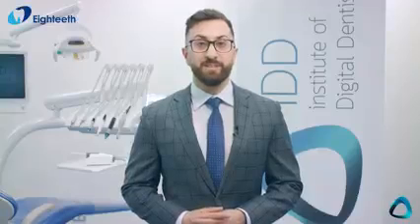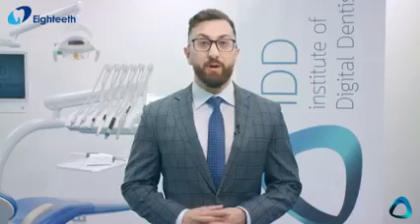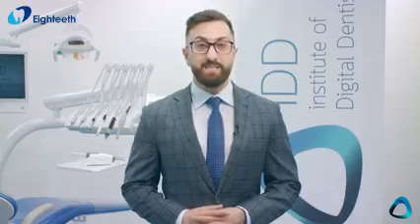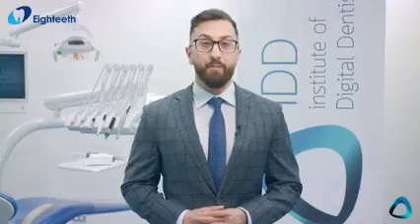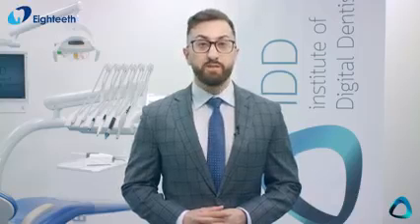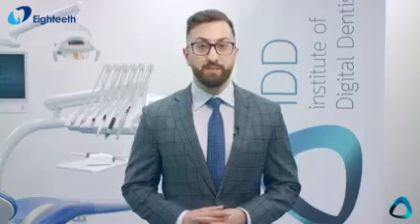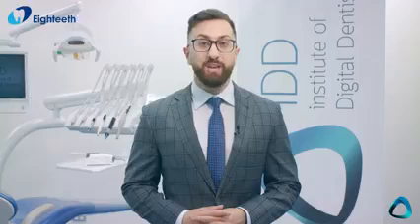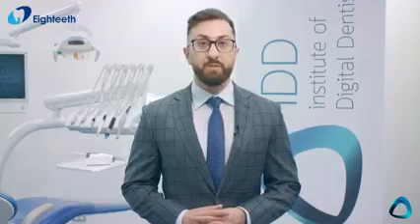Implant surgery precision can be improved by integrating a digital workflow, combining an intraoral scan and a CBCT to plan surgery that is safe and successful for your patients. From here, you can also design and print or mill surgical guides to further improve clinical outcomes. I'm going to show you how with the Helios 600 intraoral scanner, you can use Exocad to improve your implant dentistry.